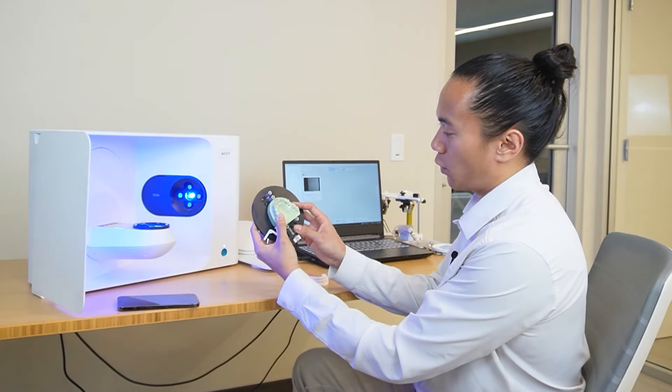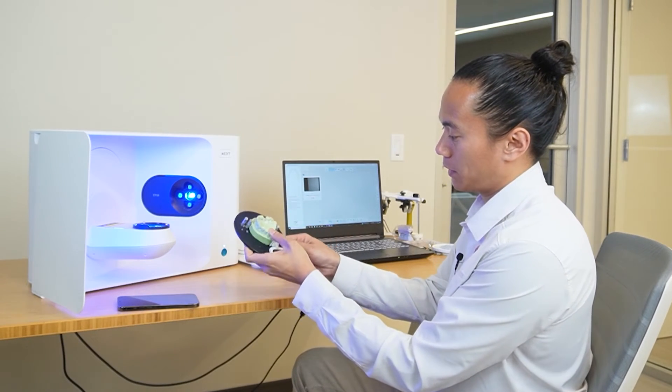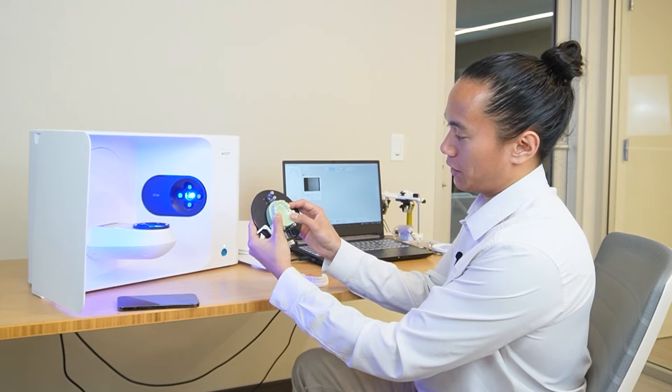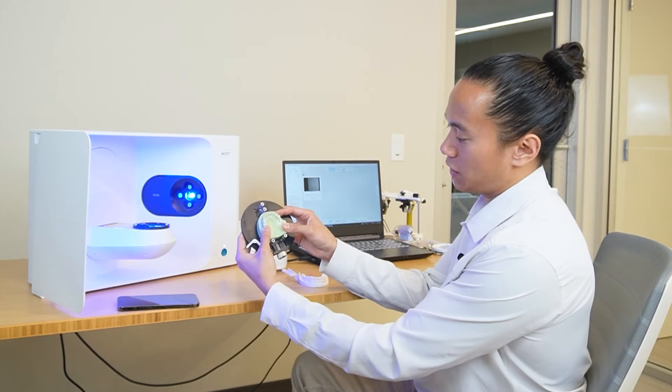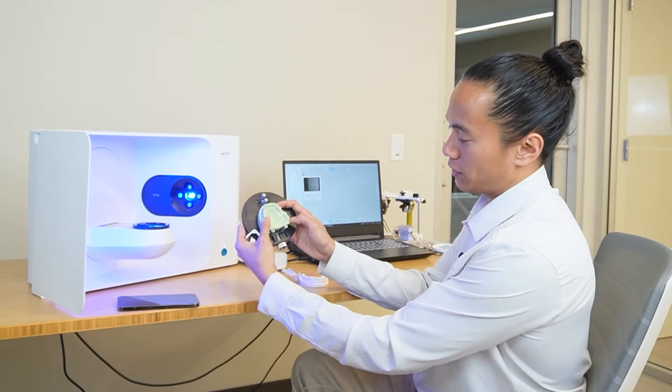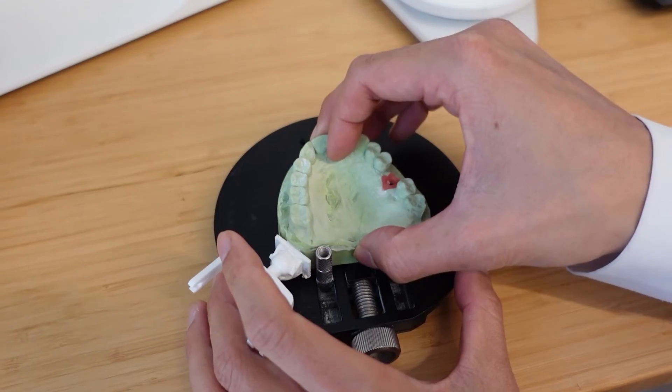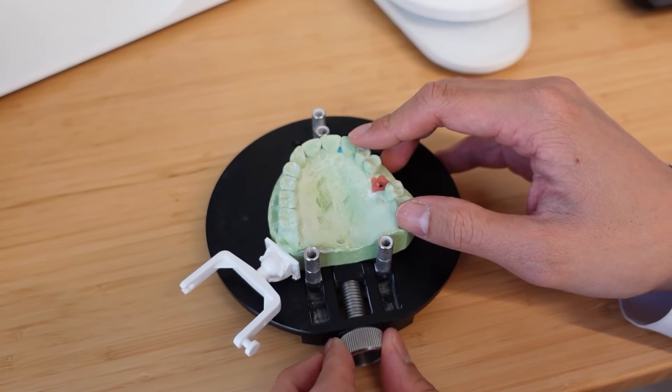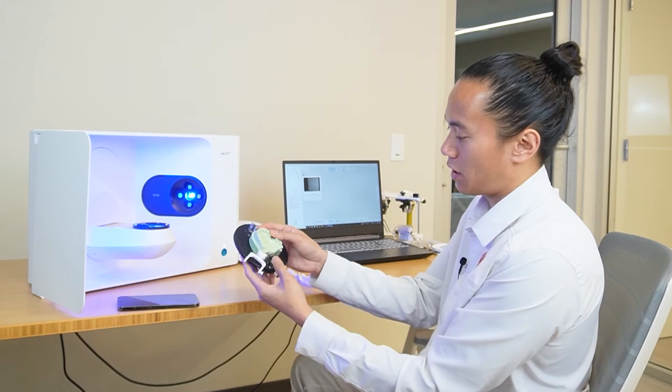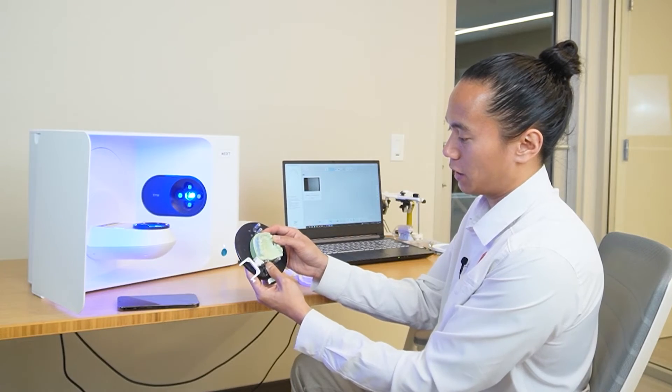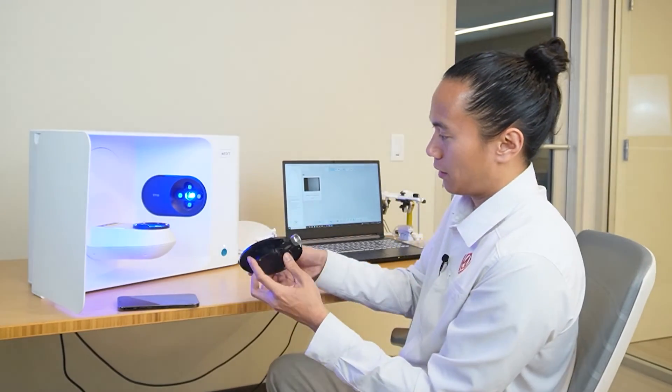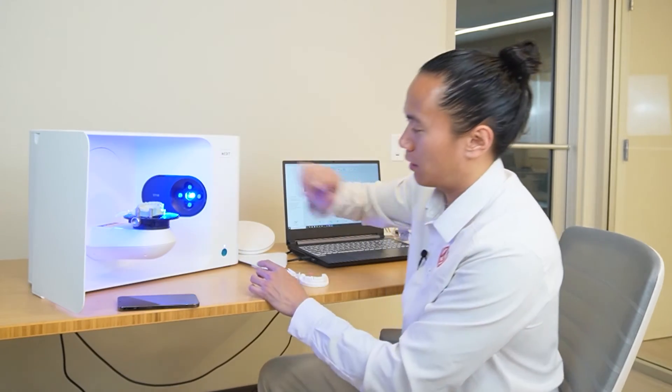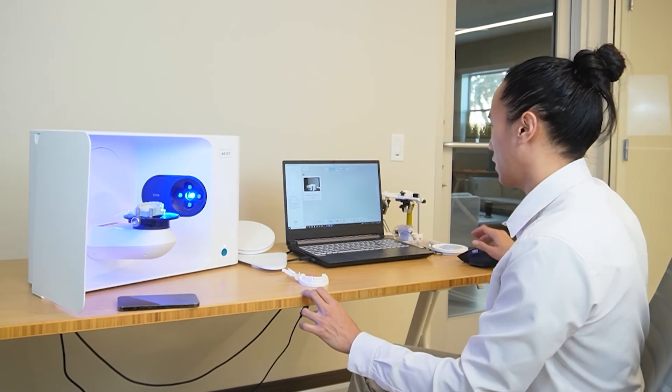Now when screwing in your model into the clamp, just make sure. Usually we like to have the anterior set towards the front of the stage and the two pins towards the posterior section here. And we'll slowly tighten up just like this. Again, as long as everything feels stable, you're good to go.